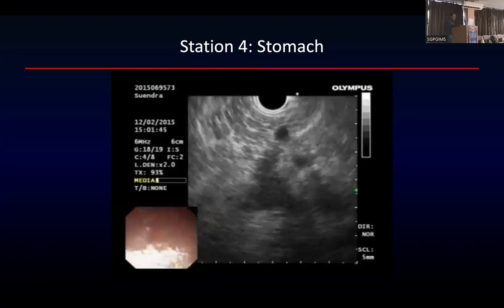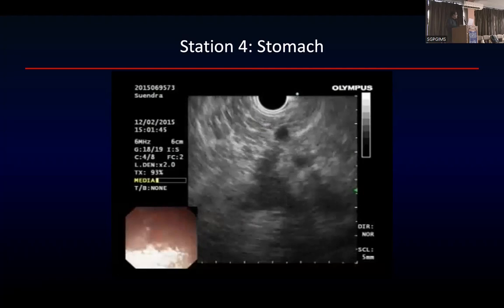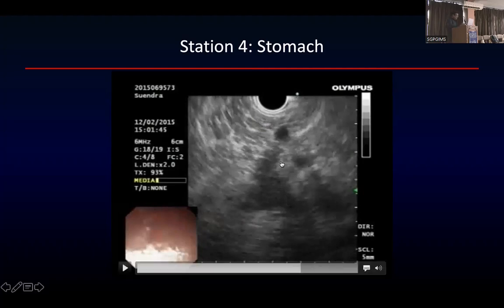Not a very good imaging, but this is all we will see when we do the case. Don't worry, we will see all these structures. This is the splenic vein coming. This is the splenic vein, and from below the superior mesenteric vein comes, and this will become the portal vein. You trace it.